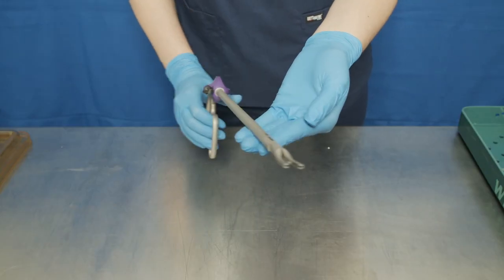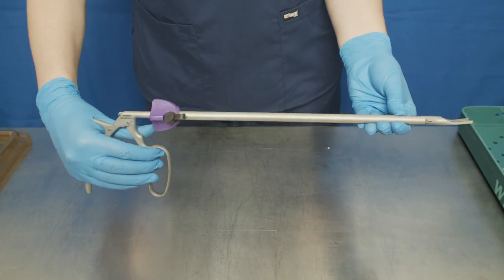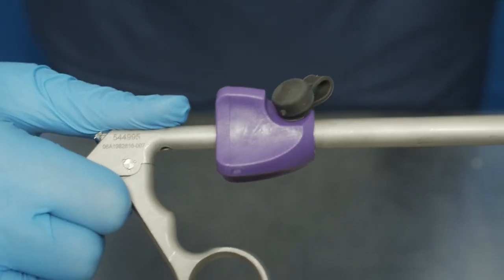After checking the applier jaws, inspect the knob for signs of wear and tear, specifically looking for chips or discoloration.